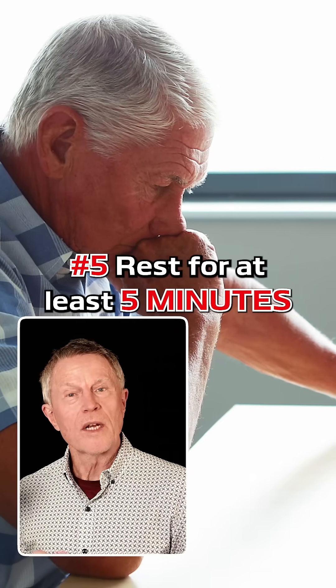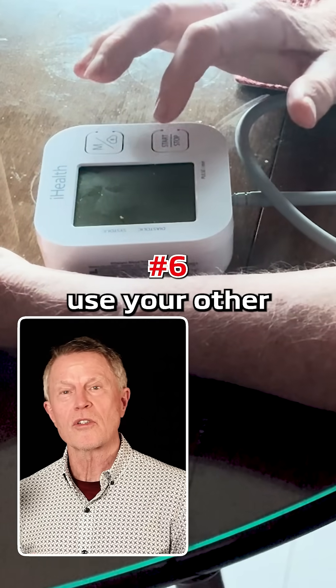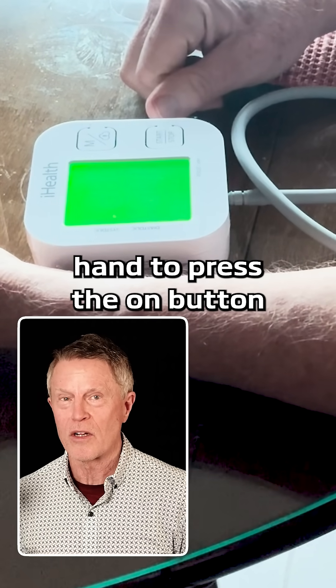Number five, rest for at least five minutes. This is also important. Number six, use your other hand to press the on button.